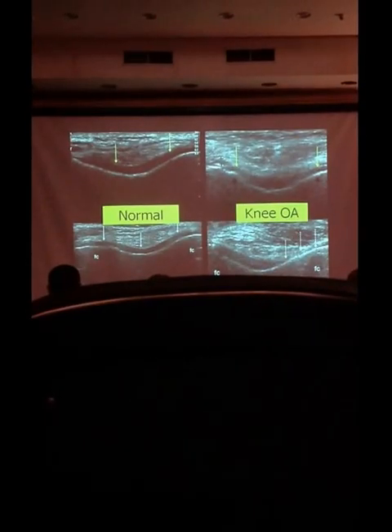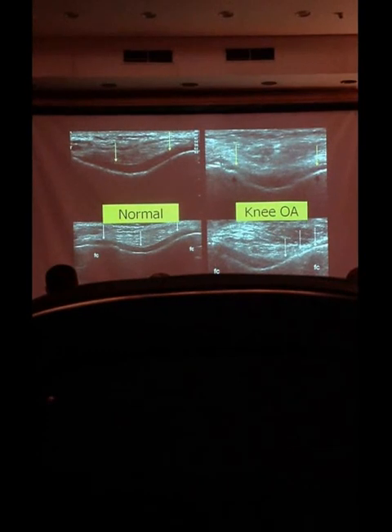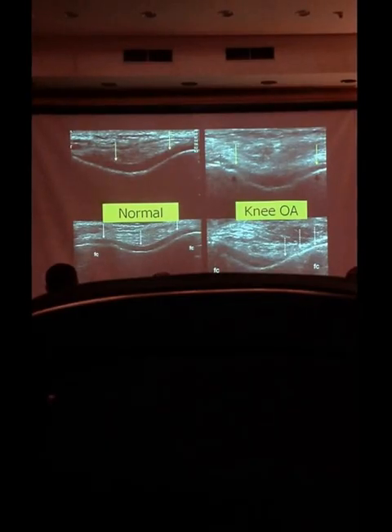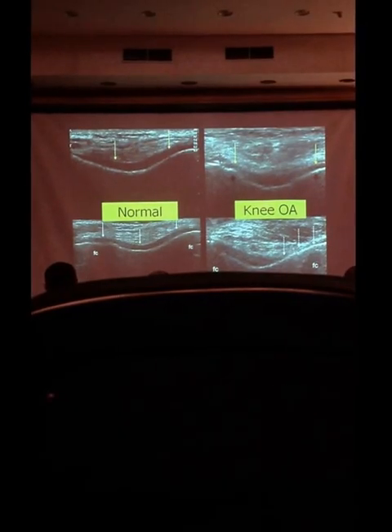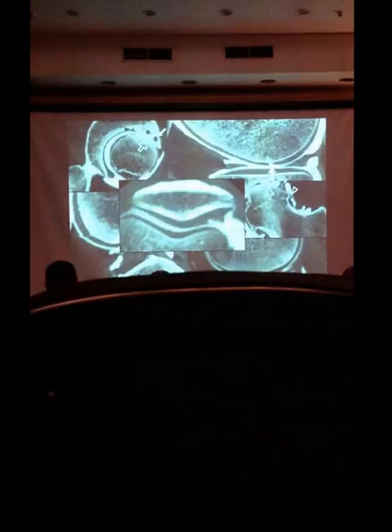On the other hand, when we see pathology, we can call it. Like in this example, I'm sure that here there's no cartilage whatsoever. So I can call for cartilage pathology using that method. That's no problem. So it's still useful. If you find pathology, great. But if you don't find cartilage pathology, there's a problem. We have to go for another method.